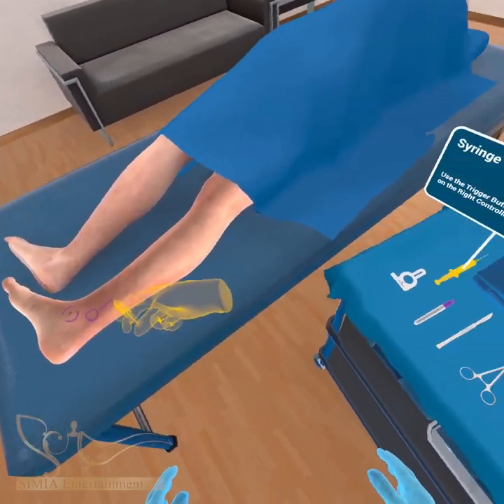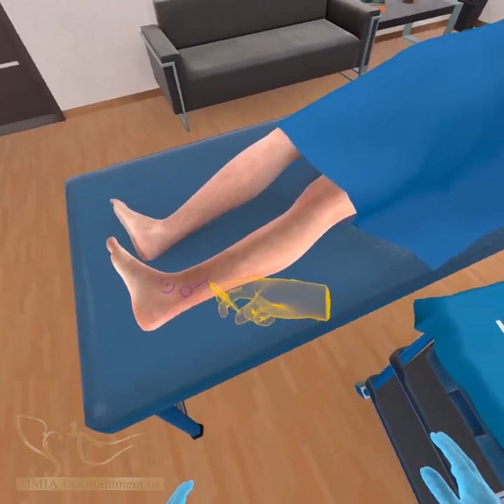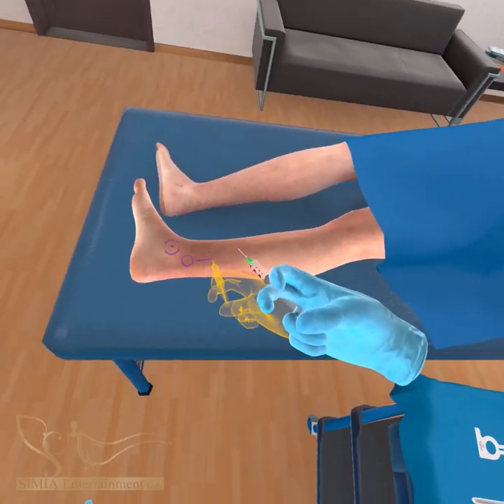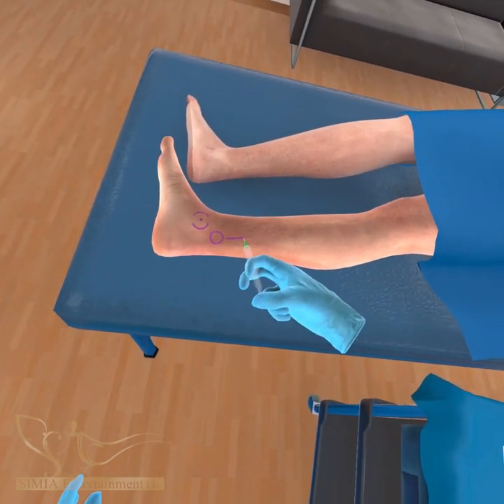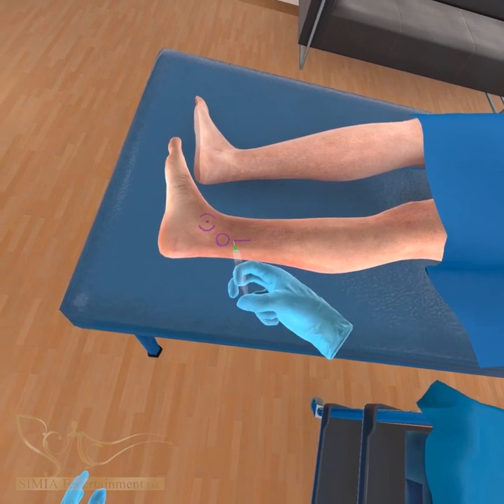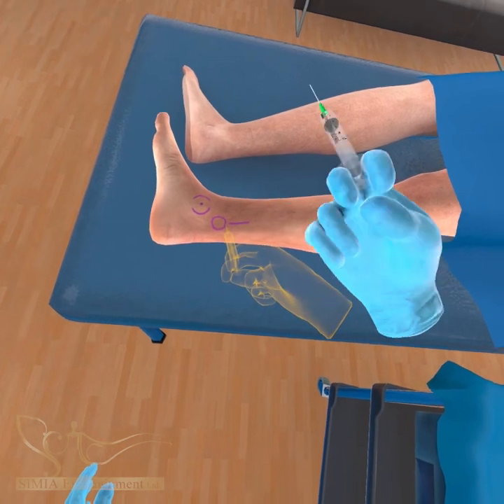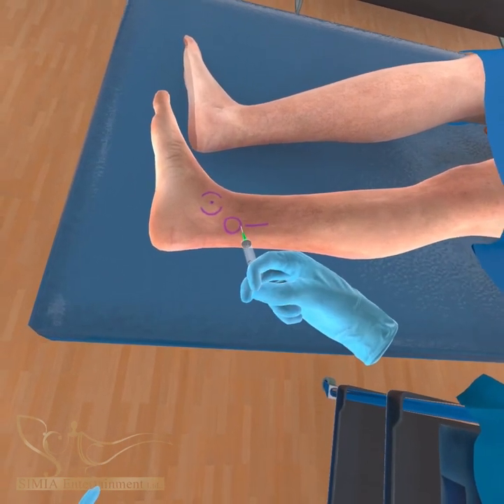Inject local anesthesia three times from the top of the marked incision line to infiltrate all the way to the bottom of the marked implant circle. Press the front index trigger button to inject at all three points. Use one-third of the 10-milliliter syringe for each injection.